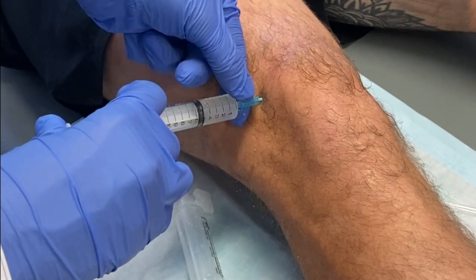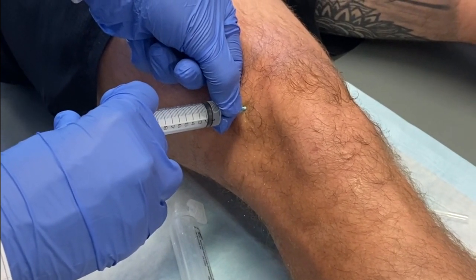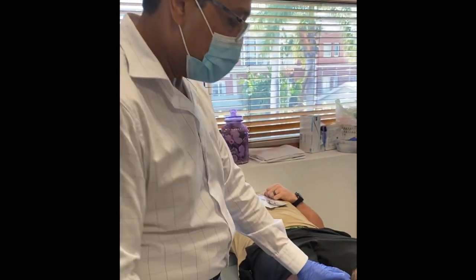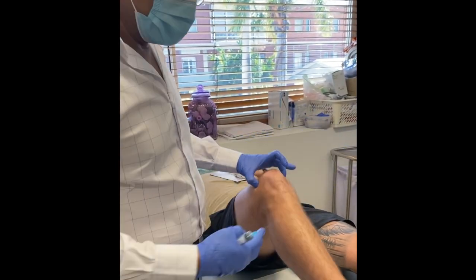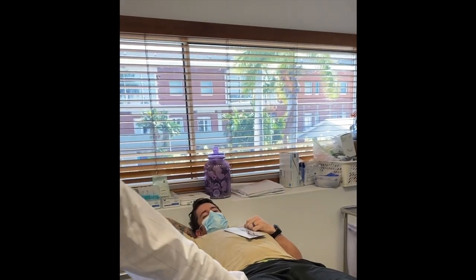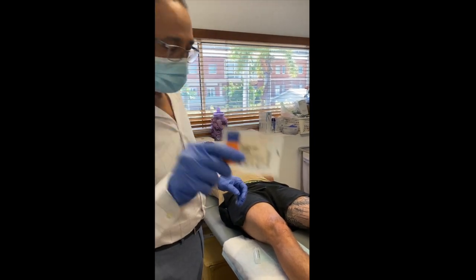Now you can inject into the suprapatellar pouch. I do a high-volume infiltration of about 10mL, because it infiltrates throughout the knee joint — the knee joint is essentially one continuous space. Then we ask the patient to flex and extend the knee, moving it up and down to make sure the steroid and local anesthetic are distributed throughout the joint.